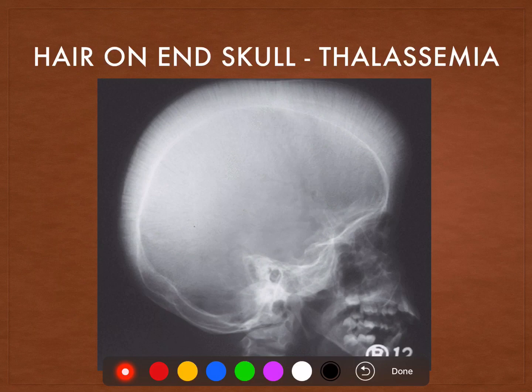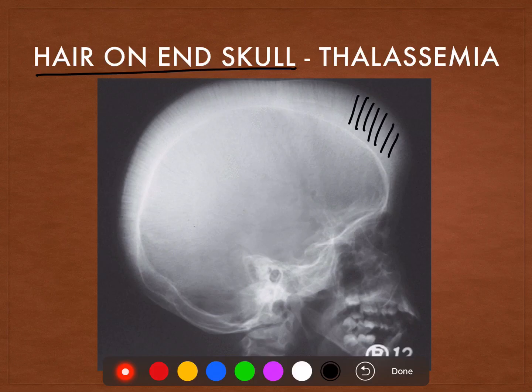This skull is known as the hair on end skull. Hair on end skull means there is diploic space widening, which is because of extramedullary hematopoiesis. This can be seen in any hemolytic anemia, but it is most statistically associated with thalassemia — hair on end skull in thalassemia.